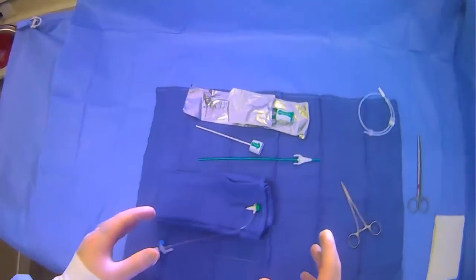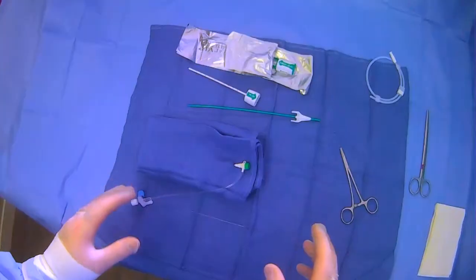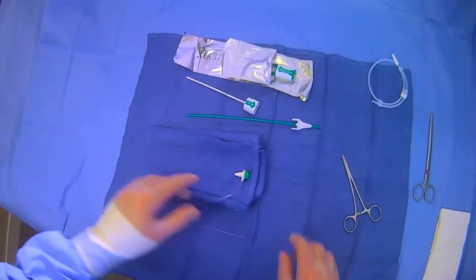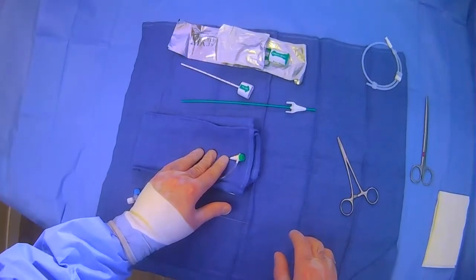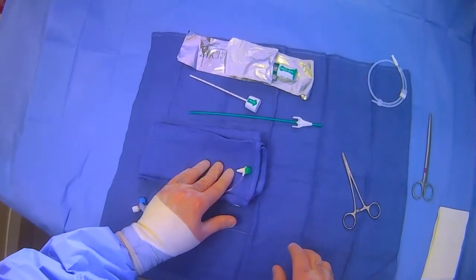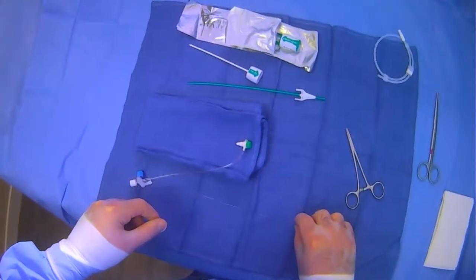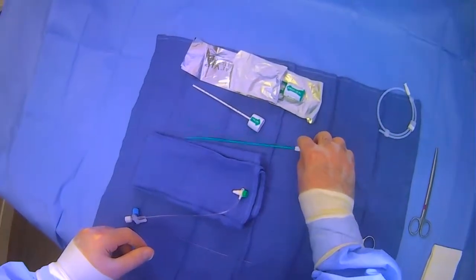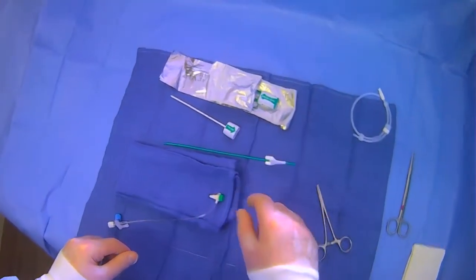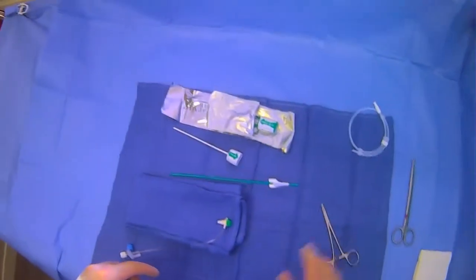Now we're going to go over how to use the angioseal device in a practical scenario. For our demonstration, let's pretend that this is our femoral artery access sheath. We have our angioseal device here, we have the wire, we have the introducer and the stylet that we'll put together, we have the actual angioseal, and we have scissors for cutting later.